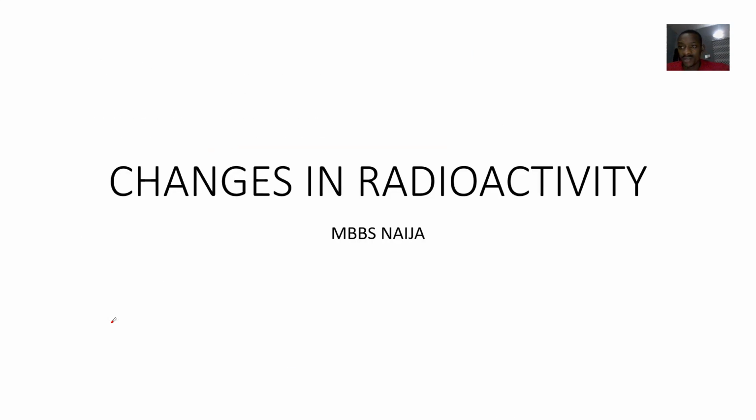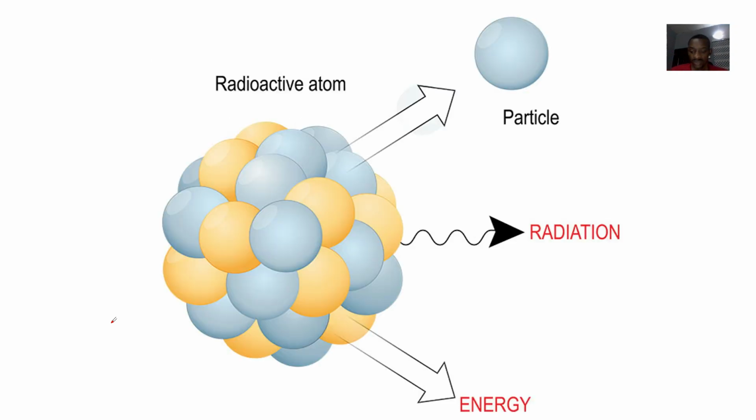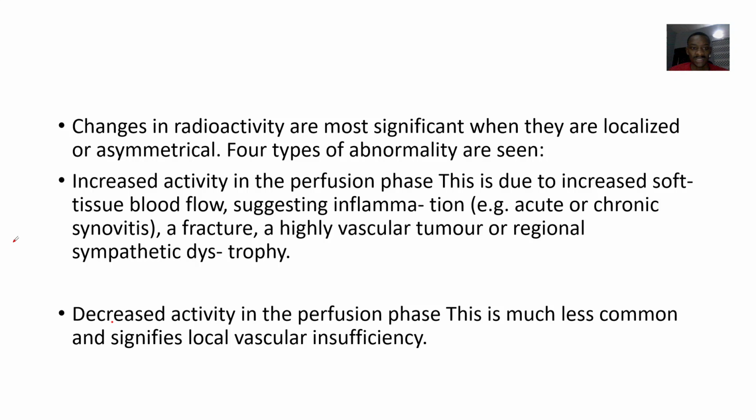So this is more of you trying to look at the meaning of changes in radioactivity. If you're having an increase in radioactivity, or a decrease in radioactivity, what does it actually mean? All right. So we're saying that changes in radioactivity are most significant when they are localized or asymmetrical.